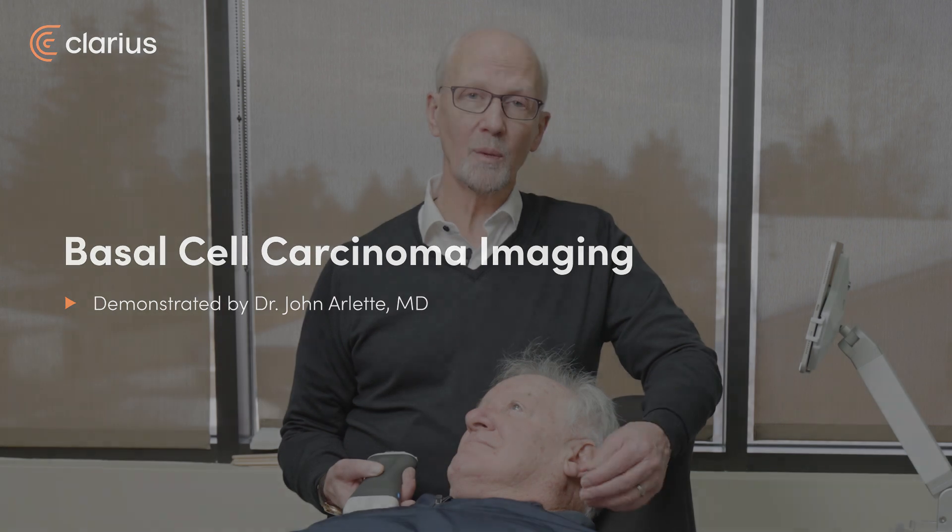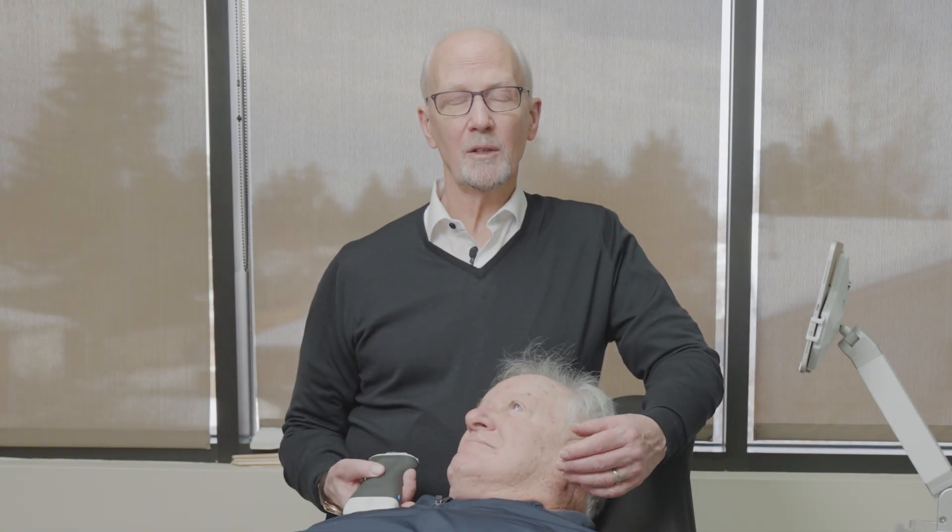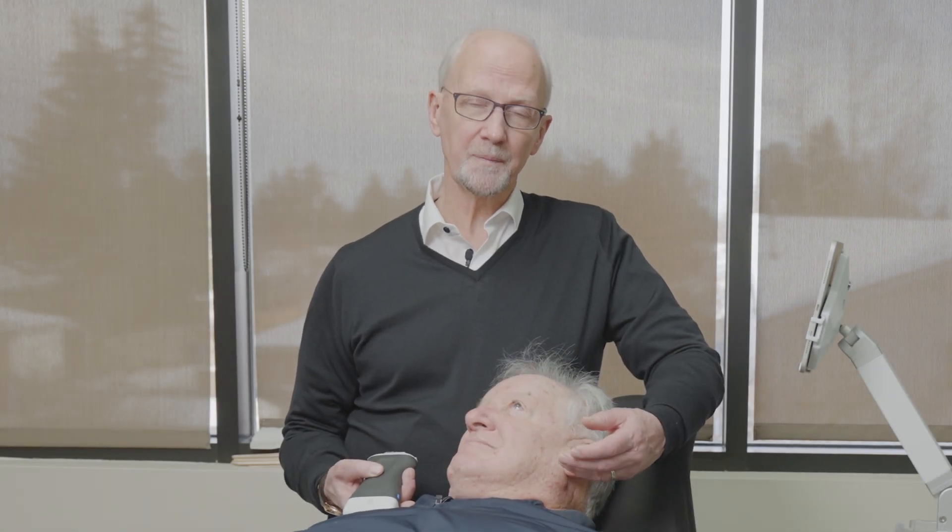We're going to use our Clarius L20-HT3 to look at a skin lesion. Our patient has had a number of basal cell carcinomas and squamous cell carcinomas.